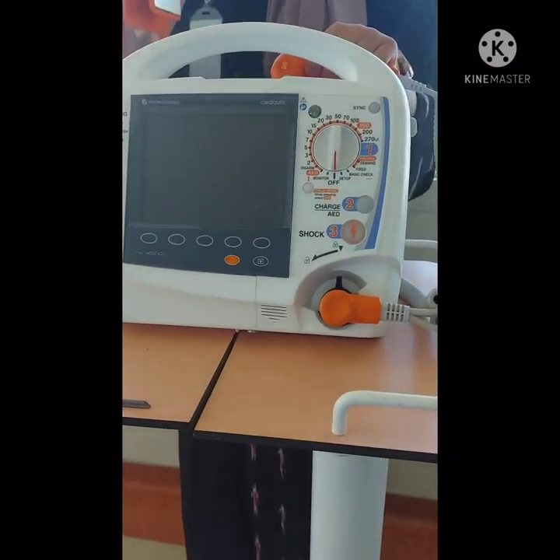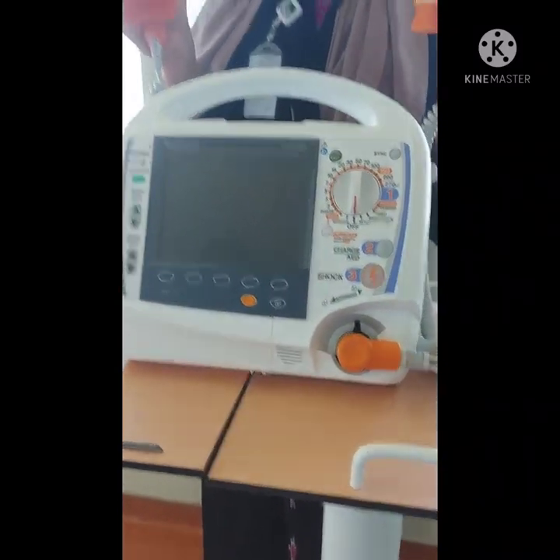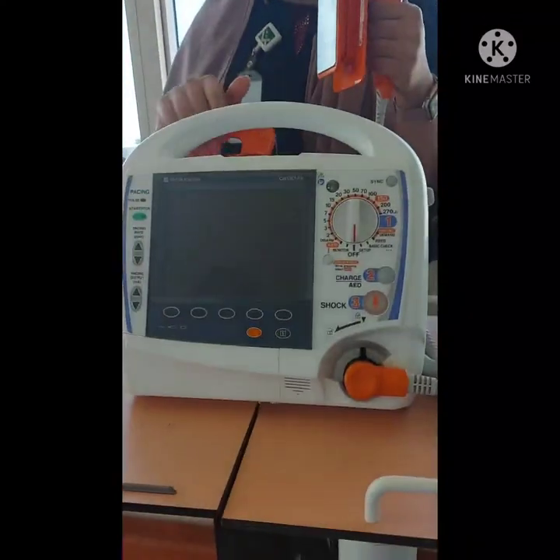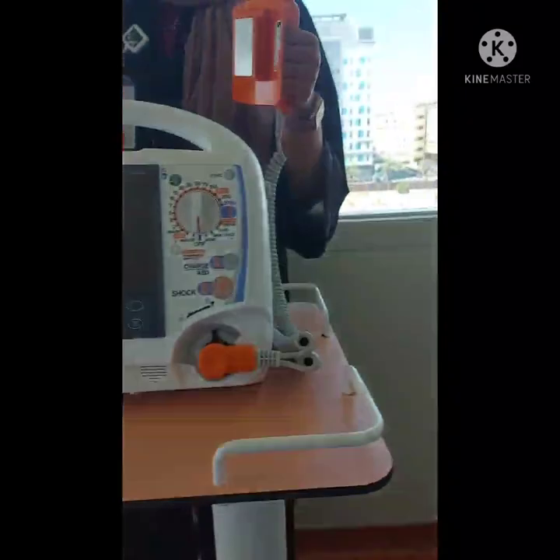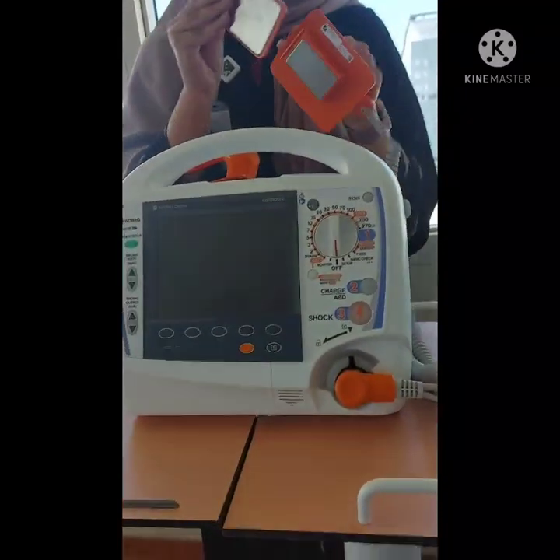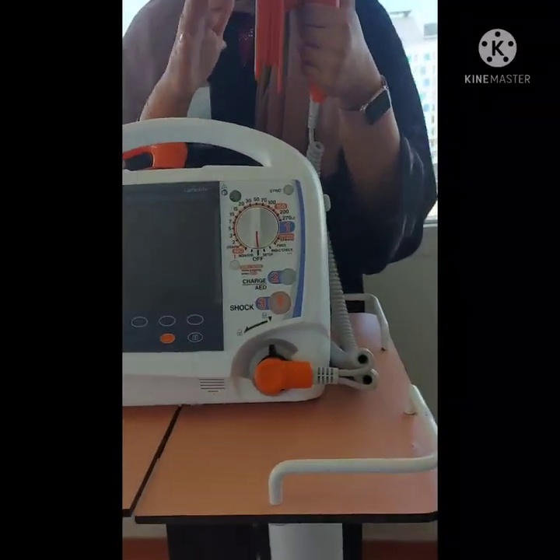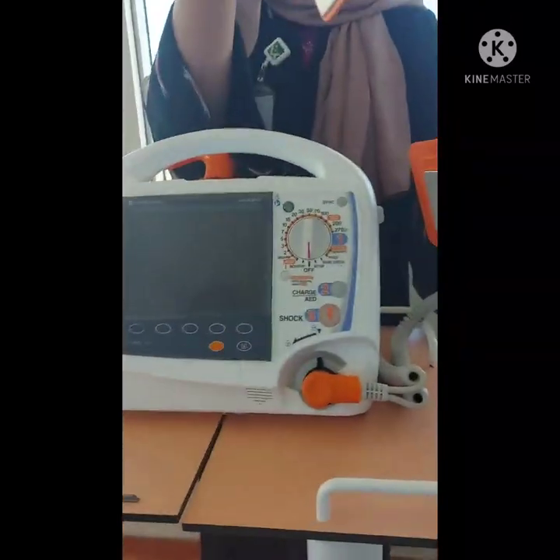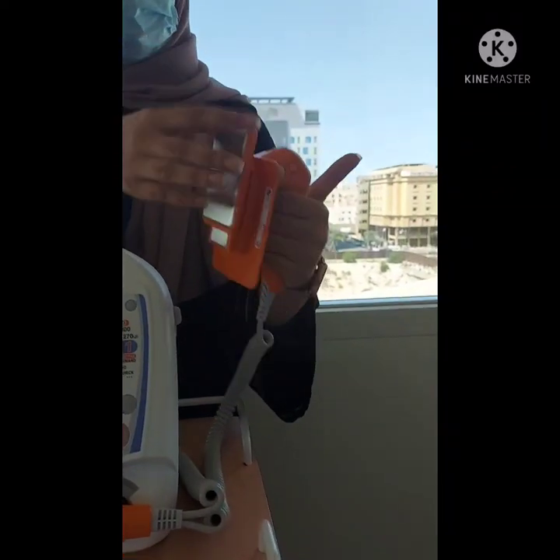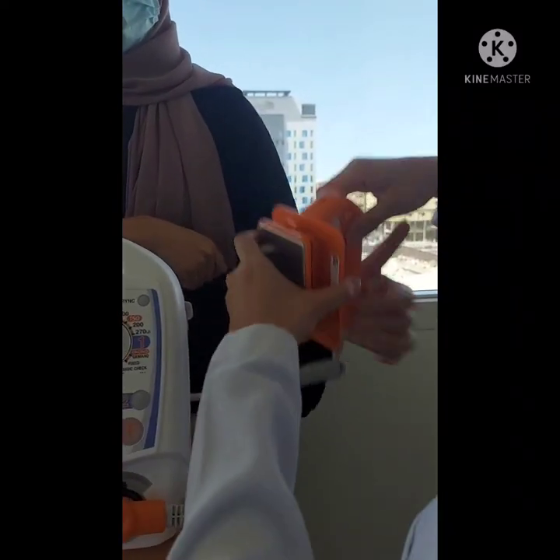Now for the paddles, it's for the adult here, and you can change it to pediatric by pressing. Much better. Nice. Because the other one is so hard. Can you remove it again? Just press. Nice. Then put it back. Can you try? Wow.